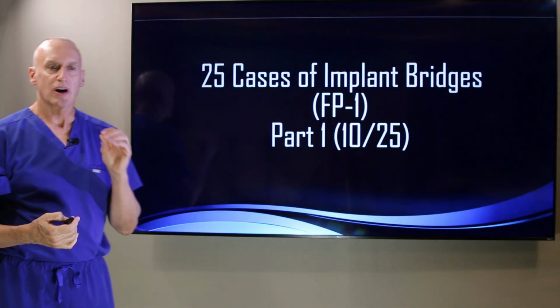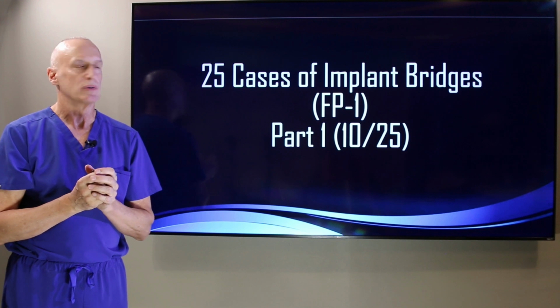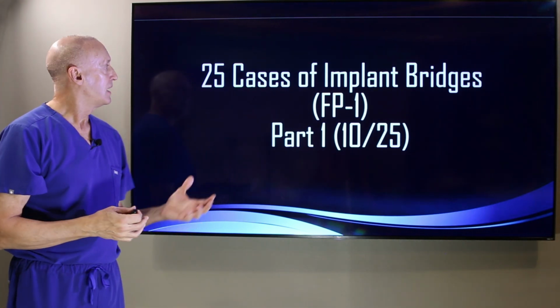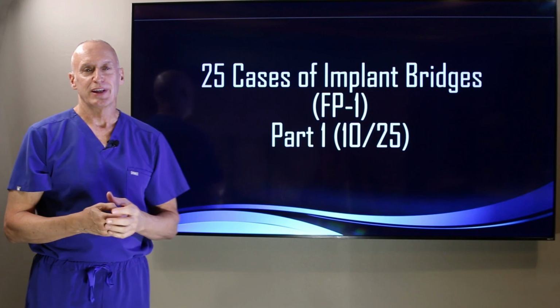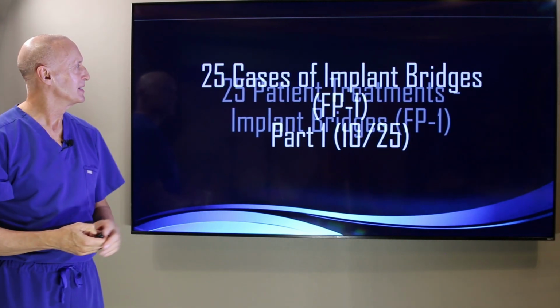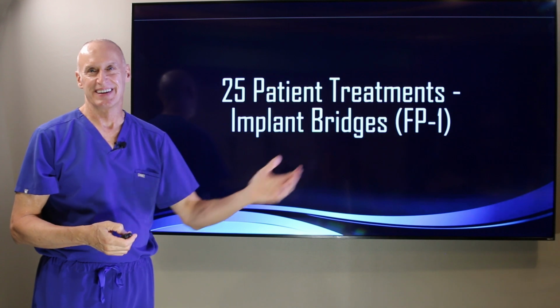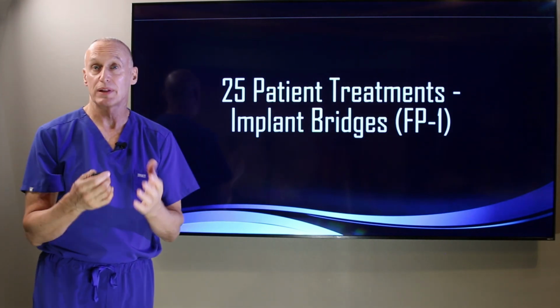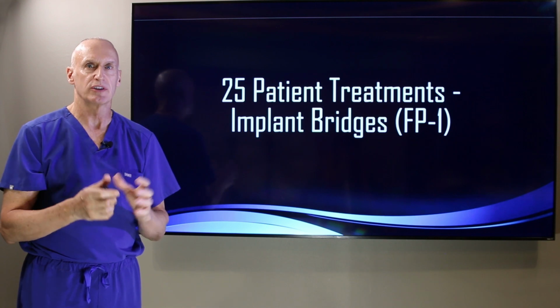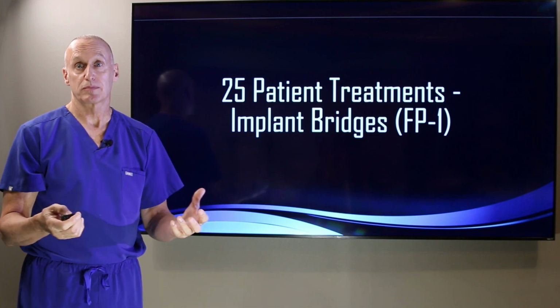So this is our office in Dallas. Today's topic, I wanted to show you 10 of our 25 most recent cases. And they say when we're presenting to the boards, they're not cases, they're actually patient treatments. But anyway, the topic is implant bridges, or FP1. And I'm going to start using those interchangeably starting this presentation.